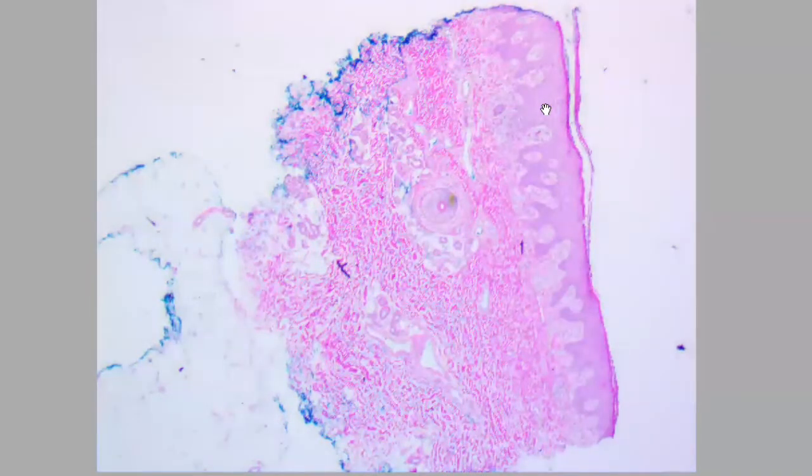From this low power also, with this proliferation of the epidermis and the acanthosis, you will find thinning of the suprapapillary plate. This one is thinned compared to the normal, and this one is thinned. This area also, and this area, they are thinned compared to the normal thickness of these suprapapillary plates. The rest of the features, I think it's better to go to a higher power to mention them one time.